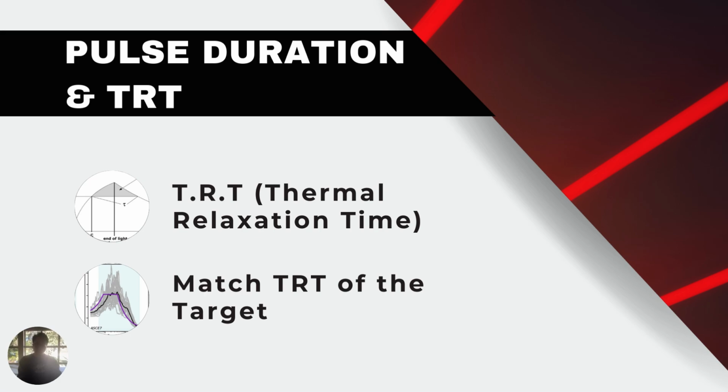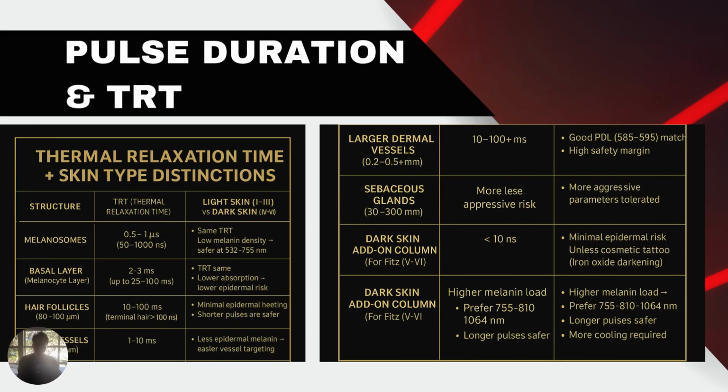And for your reference, here is a table. Based on this table, you should be setting your device no more than the thermal relaxation time. Because if you exceed these parameters, now you are causing thermal damage.